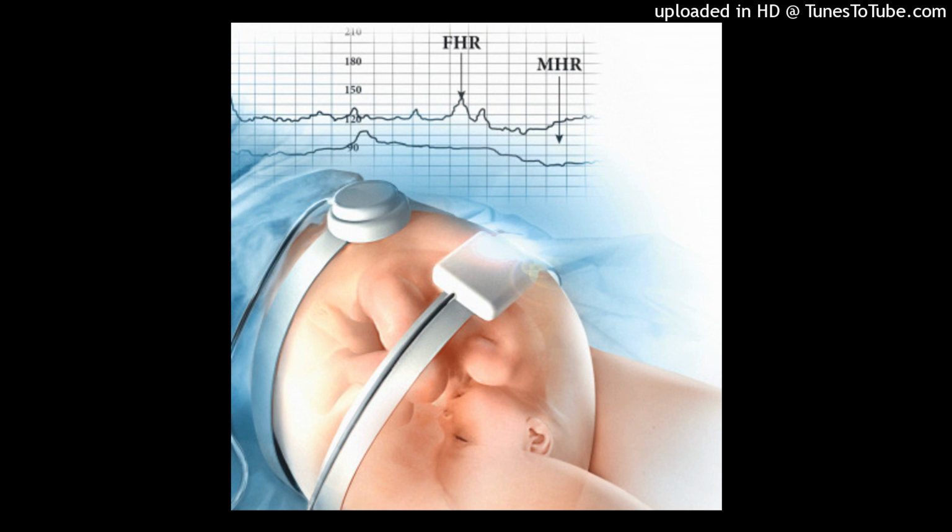From a physiologic standpoint, prolonged decelerations are difficult to classify. Some experts think the same mechanisms responsible for late or variable decelerations are responsible for FHR changes associated with prolonged deceleration, only they last longer. Regardless, a prolonged deceleration reflects interruption of oxygen transfer from the environment to the fetus at one or more points along the oxygen pathway.